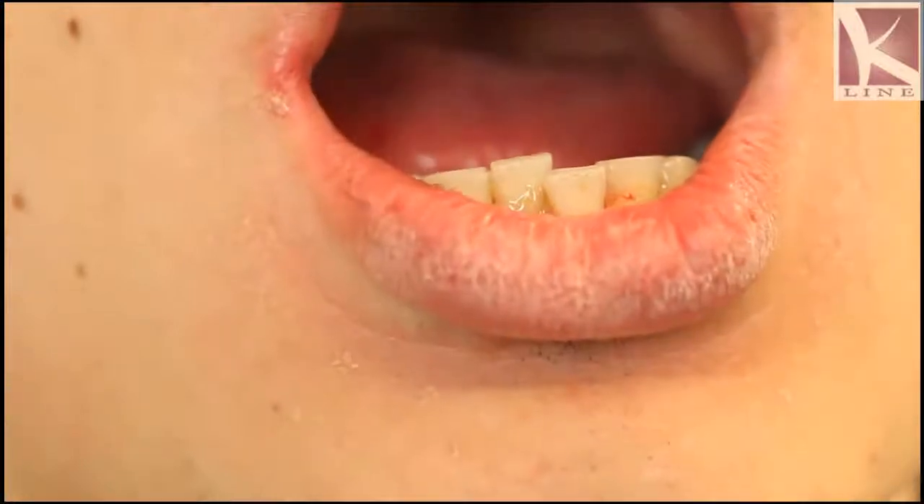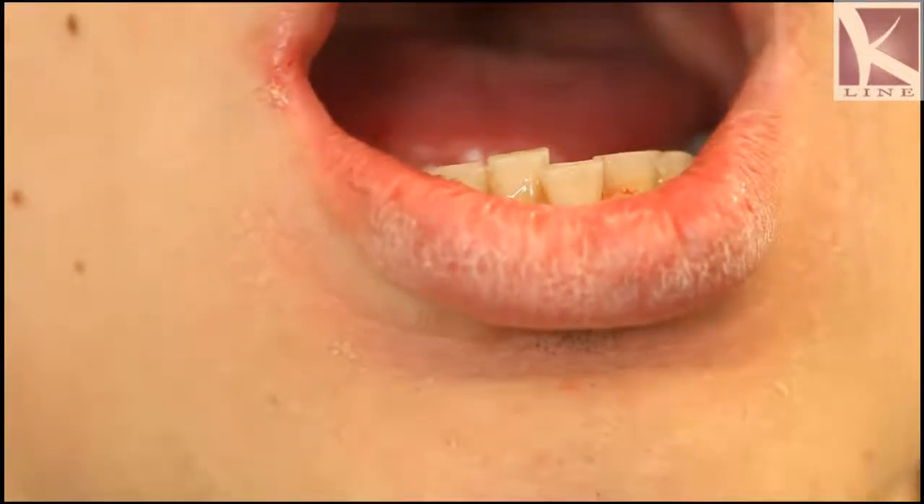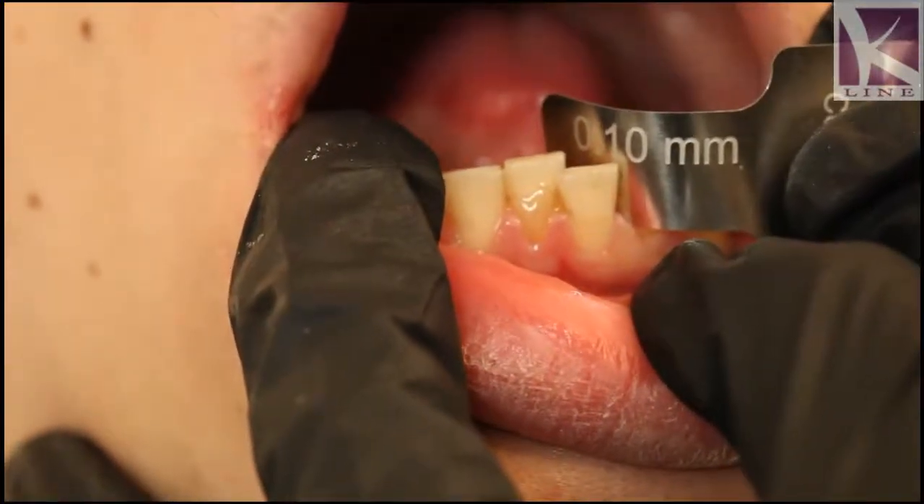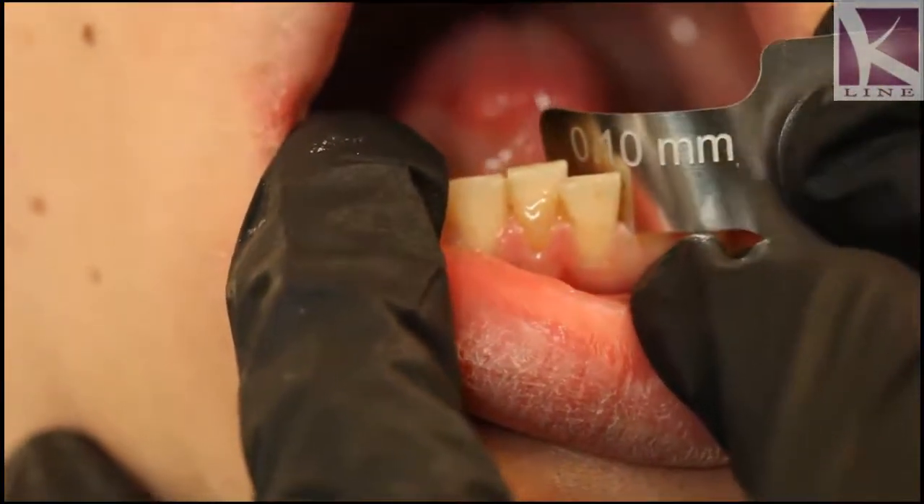Okay, once again — and this time it is fitting in really good. The pins have reached my 0.1 mm.